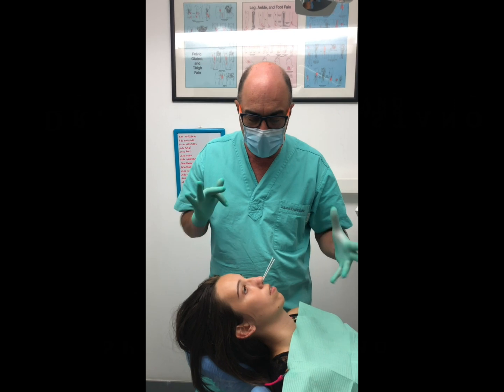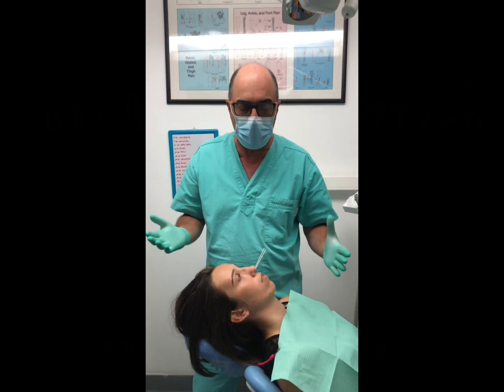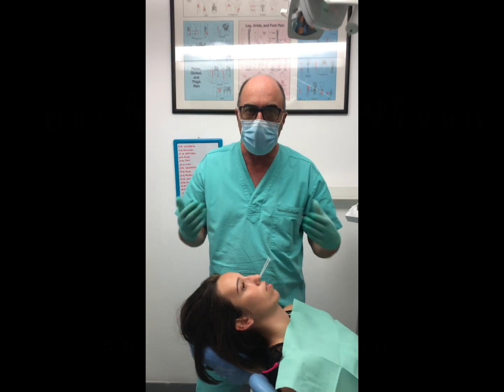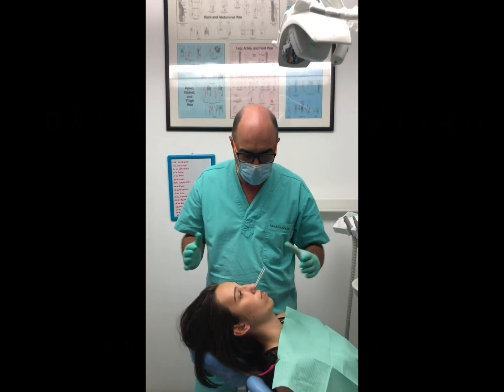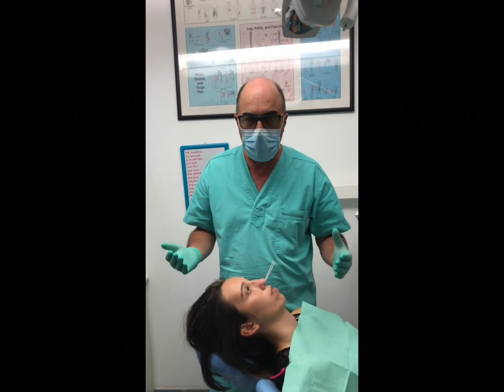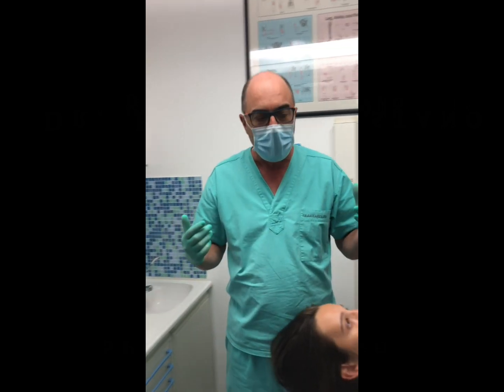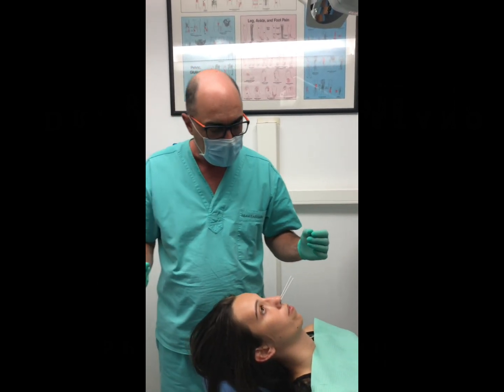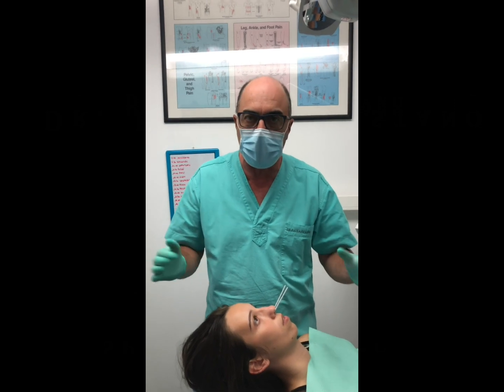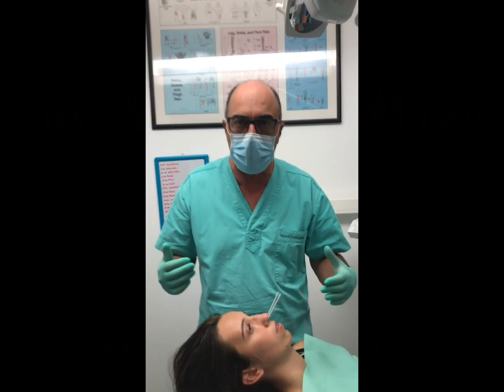This patient can't come here every day or every other day — it's complicated, she doesn't live so close. So what we're going to do is teach her to do this by herself. It's quite easy: we give her some applicators, we give her some lidocaine, and she can do this at home. The prescription and how many times she'll do it at home depends on how severe the problem is.